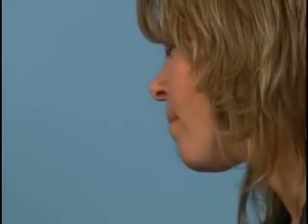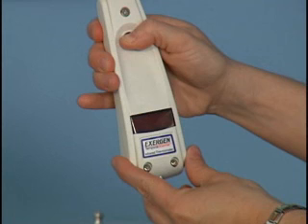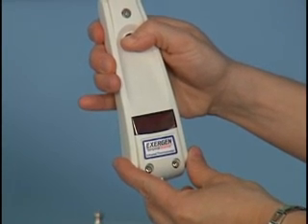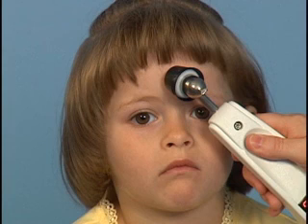Choose either side of the forehead. Brush away any hair that is covering the site. Hair traps body heat, resulting in a falsely high temperature reading. Hold the thermometer with your dominant hand, your right hand if you're right-handed, and your left hand if you're left-handed. Place your thumb on the scan button. Gently position the probe on the center of the patient's forehead, midway between the eyebrow and the hairline.